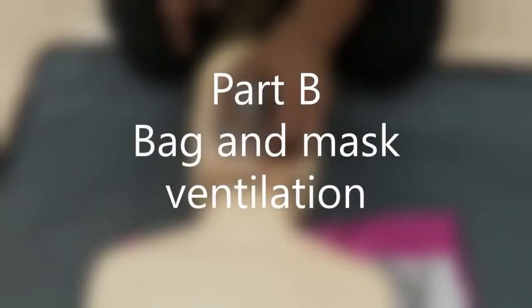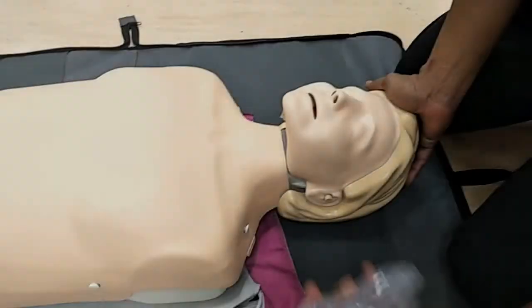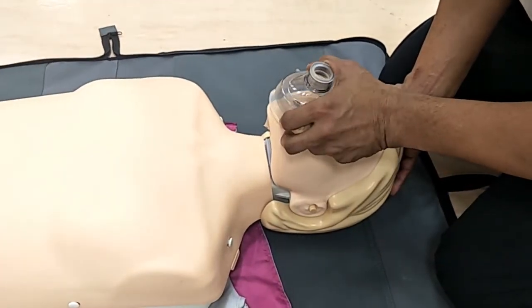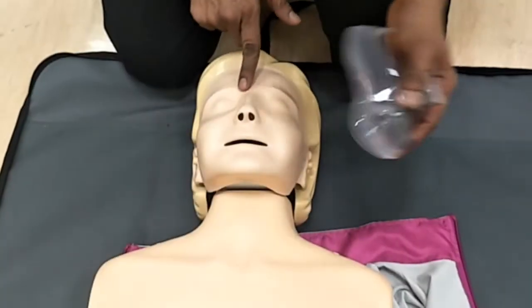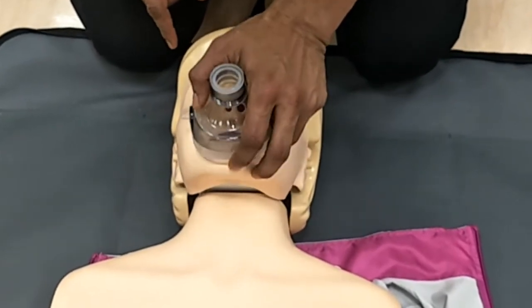Part B of this video will show the correct technique of bag and mask ventilation. First, size the mask that you would want to use. Ensure that the mask covers both the nose and the mouth. The upper border should sit at the bridge of the nose and the lower border just below the lip without extending beyond the chin.